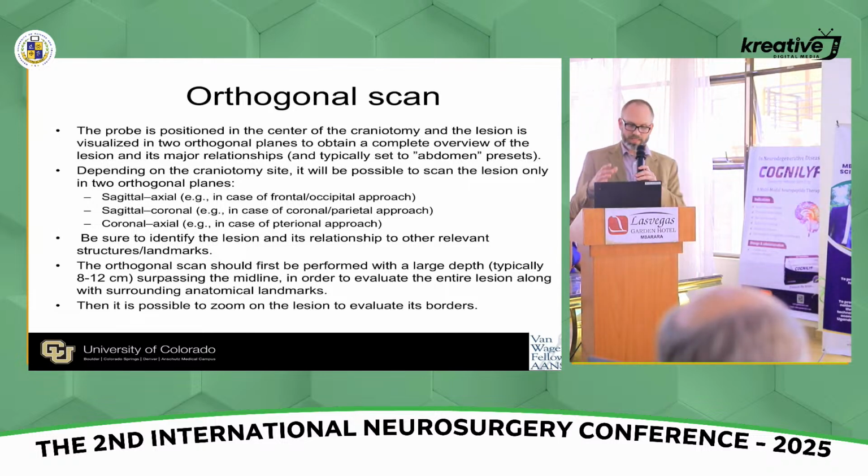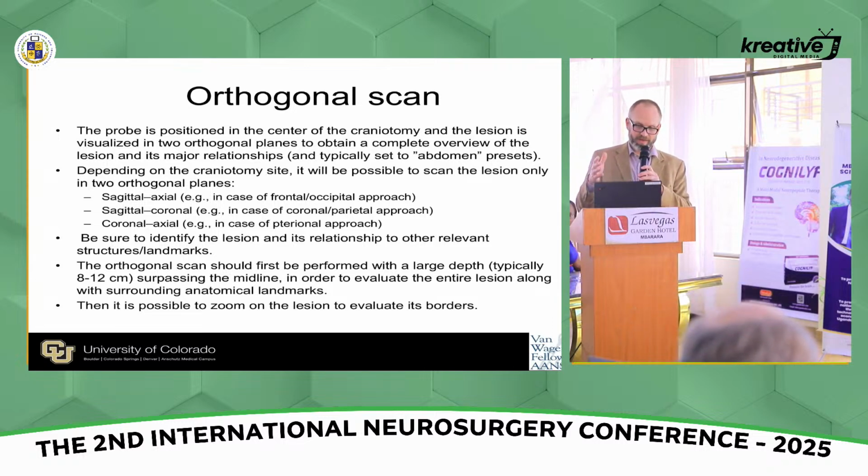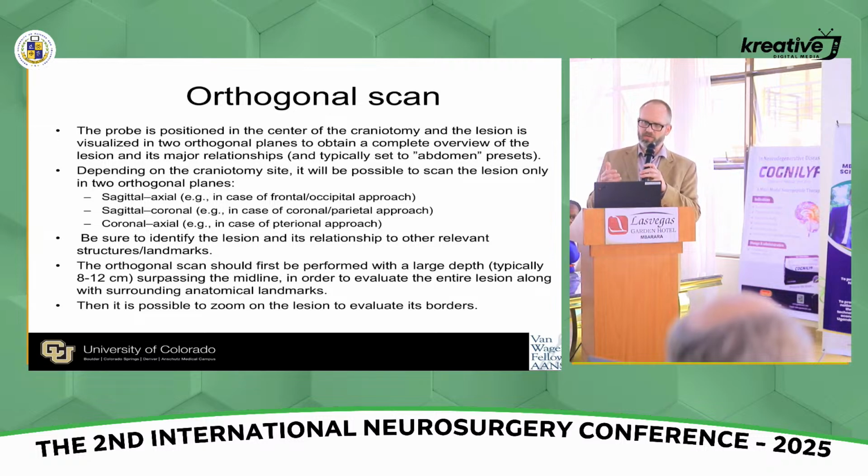And then you want to scan. I usually scan before dural opening, especially with navigation, to help ensure that your exposure is adequate. Then you open the dura and look again, because you'll get attenuation through the dura. It's nice to be right on the surface of the brain with the probe to see the tumor better.